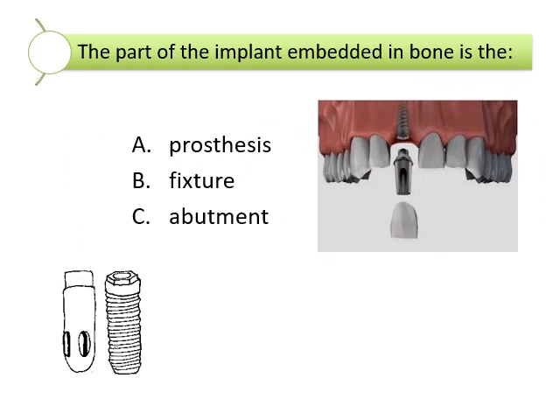So the part of the implant embedded into the bone is the fixture. And again, you might also hear this referred to as the body. But remember, it's the root replacement. It's the fixture.